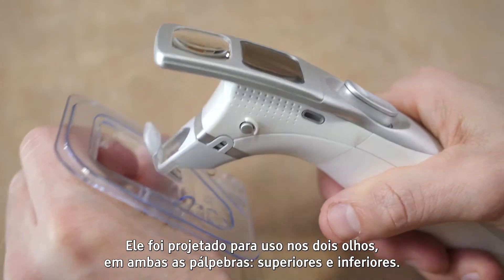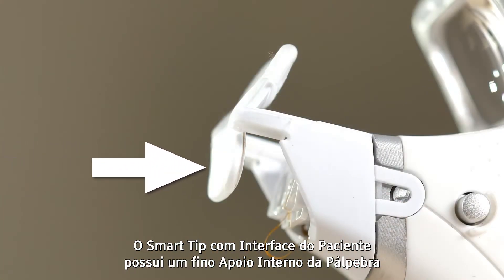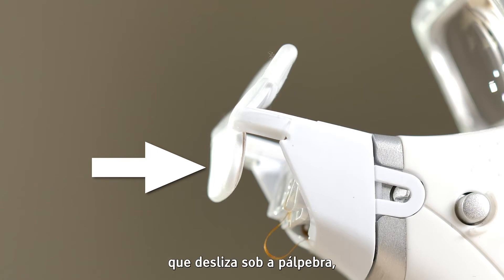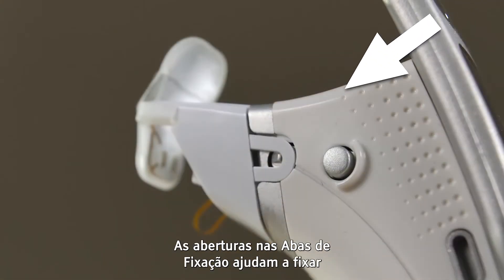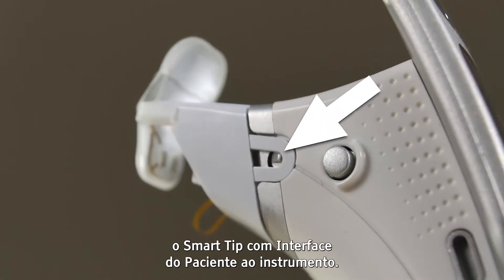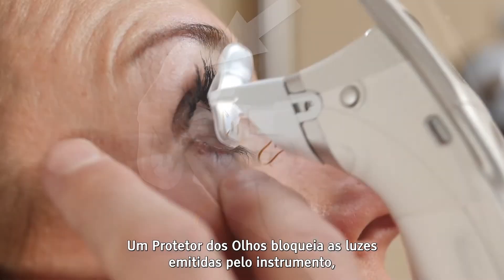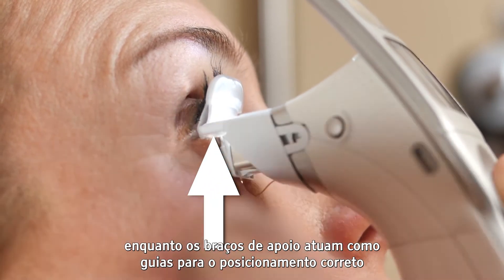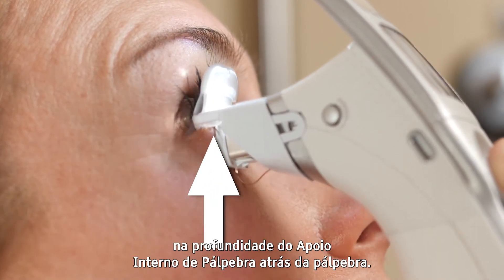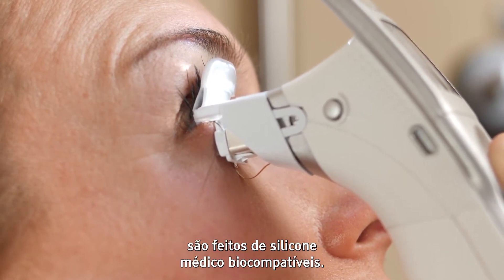It is designed for use on the upper and lower eyelids of both eyes. The smart tip patient interface has a thin inner eyelid pad that slides underneath the eyelid and an outer eyelid pad that is pushed against the outer surface of the eyelid. The openings in the attachment tabs secure the smart tip patient interface to the instrument. An eye shield blocks stray light emitting from the instrument, while support arms serve as a guide for the proper placement depth of the inner eyelid pad behind the eyelid. All materials that contact the patient are biocompatible, medical grade silicone.